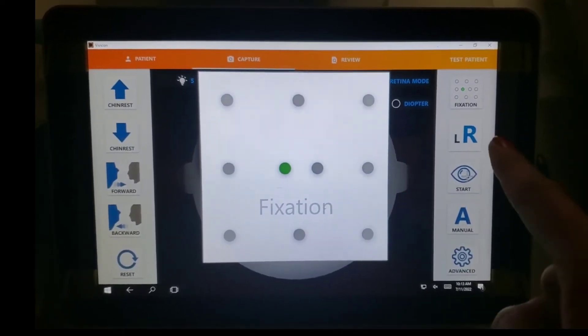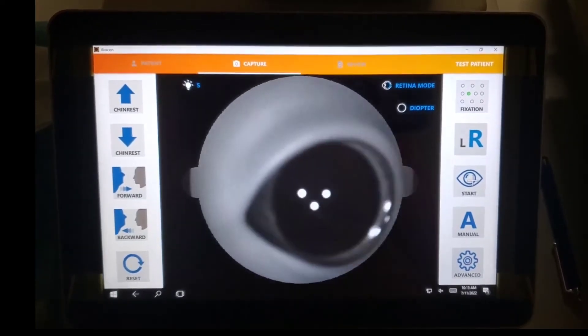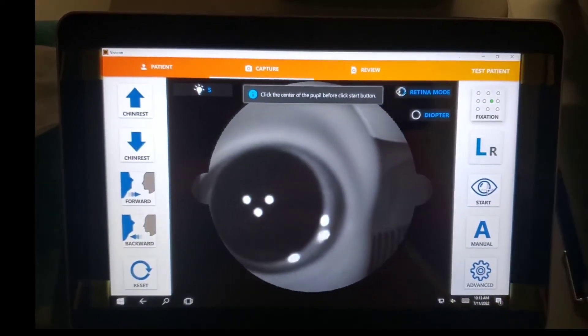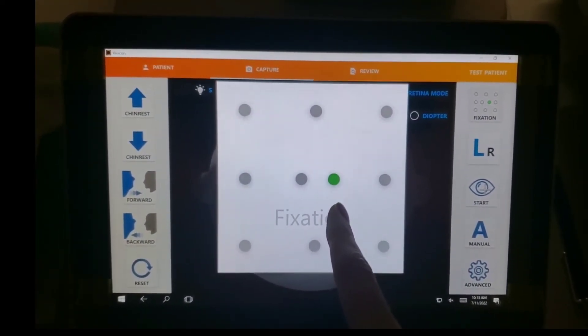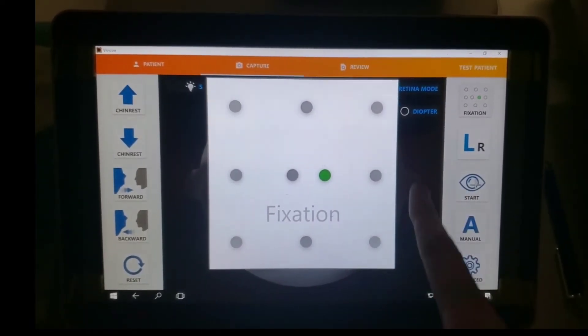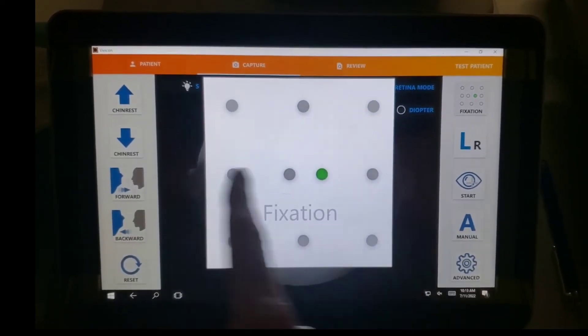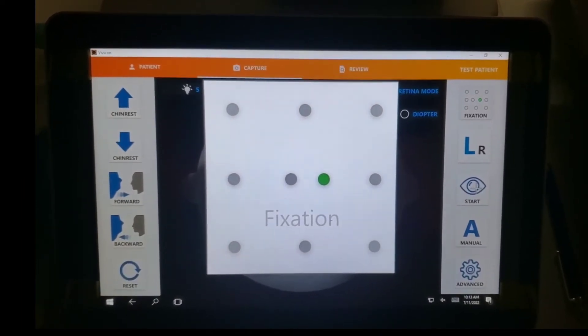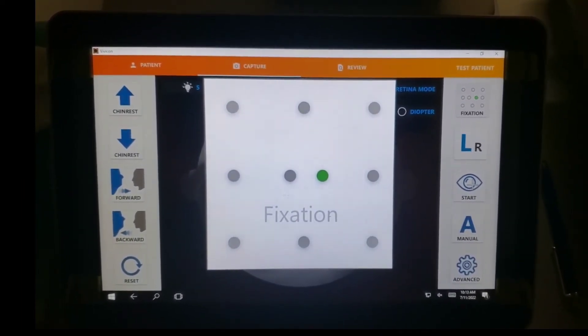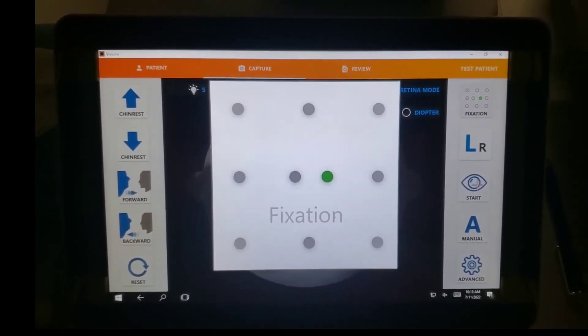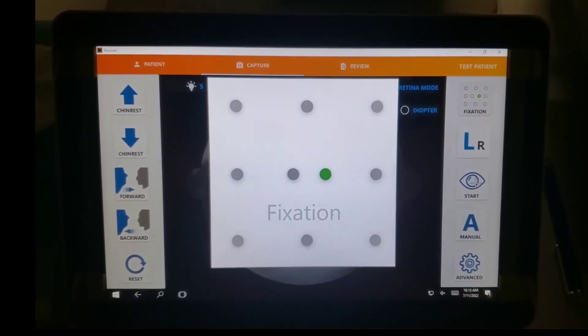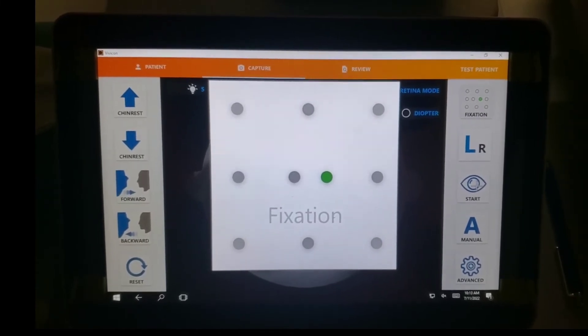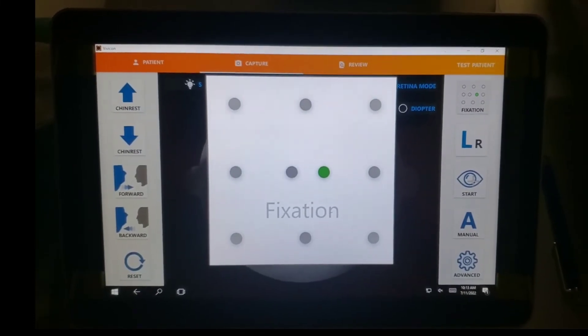This is for the right eye, so I'm going to click out of here and go to the left eye. I'm going to click fixation. Now this circle here is highlighted because that is the central nasal of the left eye. So the outer side is now your nasal on the right here, and then the left side is your temporal. So that does get a little bit tricky. We don't do a lot of special request scans, but you never know if we have a patient who has a defect out in the periphery, we might have to change up the fixation. But most of the screening photos that we offer to the patients, they're going to be done in the central nasal fixation.